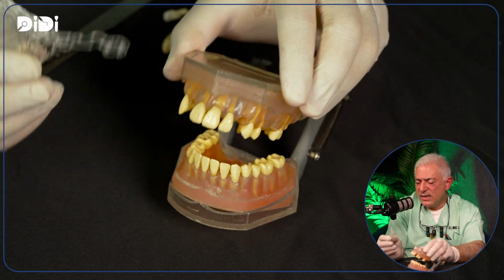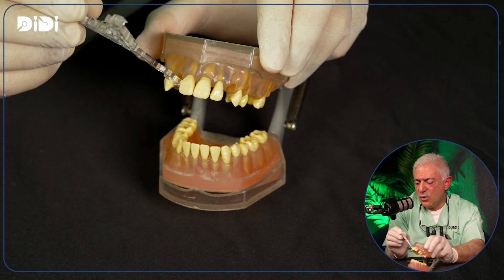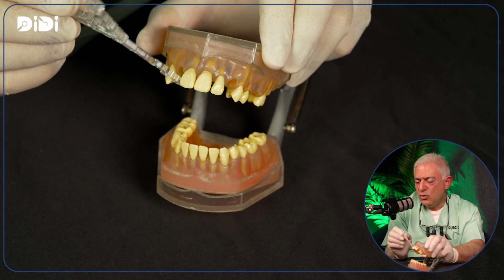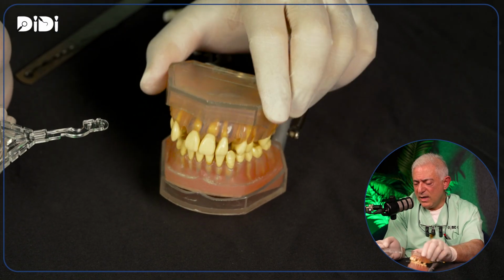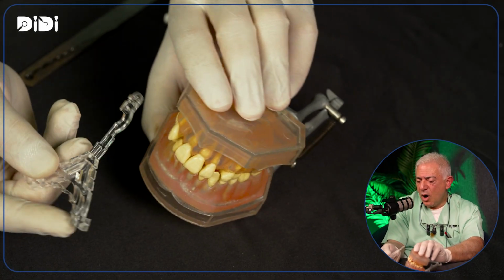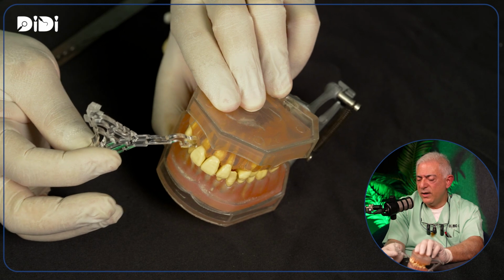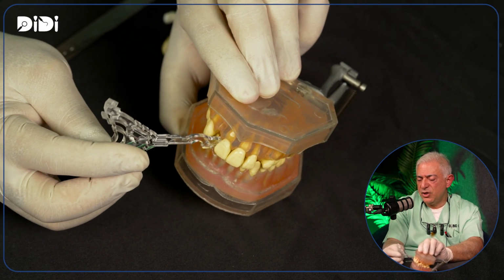You take this device in 1 second and you just go through. If it does go in, that means the patient has 7 millimeter. That means you have enough room distally to place an implant. Then you ask the patient to close, and you take your 7 millimeter object, but vertically this time, and you go through. It doesn't go in. That means you cannot place a cementable restoration.